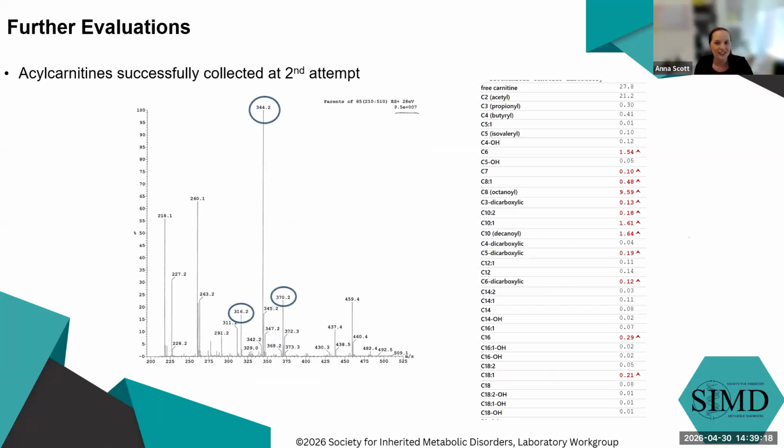I just wanted to highlight here because again, urine organic acids are most powerful in complement with our plasma testing. And here's a really great example. Sometimes you've got one sample type, sometimes you've got the other one. It can provide key information to justify next steps.